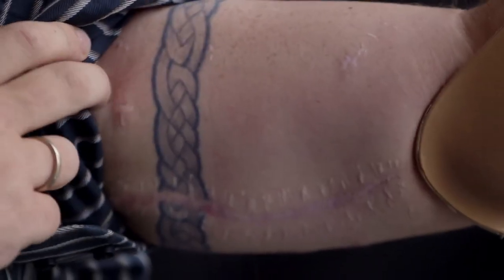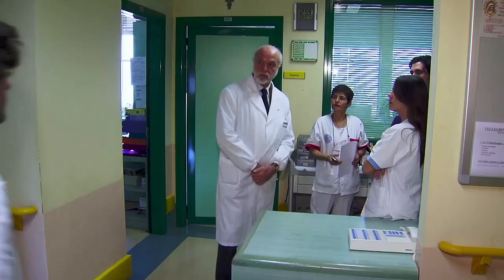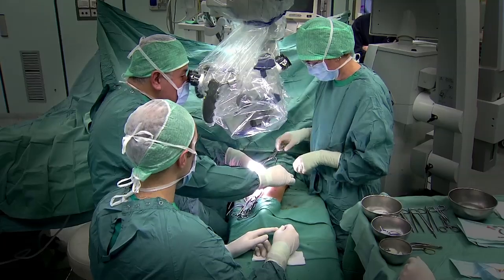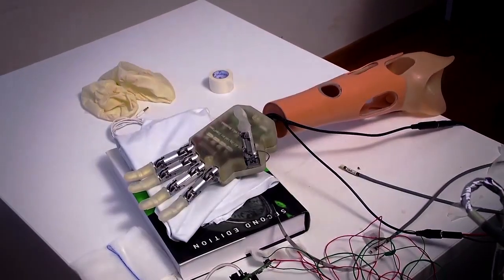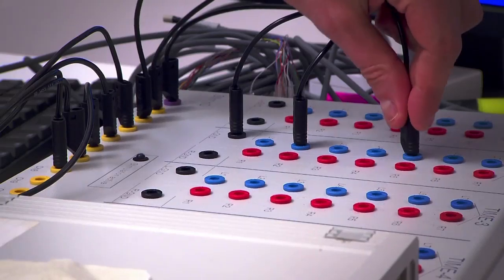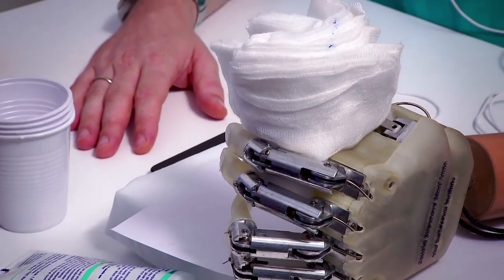For me it was kind of a duty when I thought this is so exciting and I really would like to be a part of this huge project. Dennis traveled from his home in Denmark to Rome where he underwent a grueling seven-hour operation. Four electrodes were implanted into his nerves which connected to this hand via a computer interface. What happened next was remarkable.